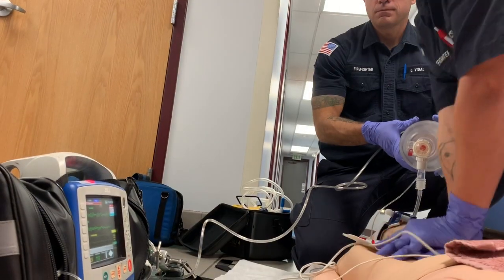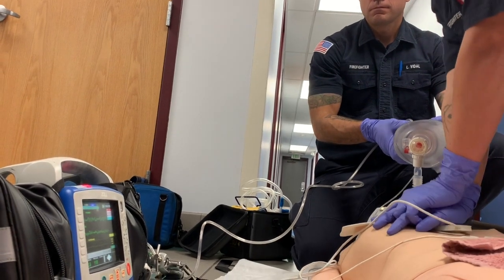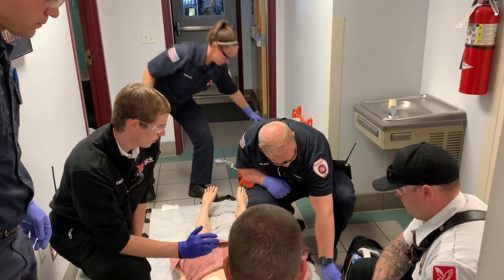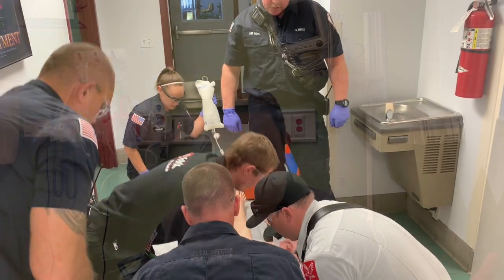Also, my expectation is that the cardiac monitors are placed in such an area during resuscitation that the ventilator, the chest compressor, and the lead paramedic can all see what is going on on that screen. And if you're the lead paramedic, you need to be looking at all of it and making sure that the chest compressor that you have on is doing chest compressions. And if they're not, you need to verbally coach them to do it. Or if they're fatigued, you may have to verbalize that we're going to change rescuers or change chest compressors because that person is too fatigued to continue to do chest compressions any longer.